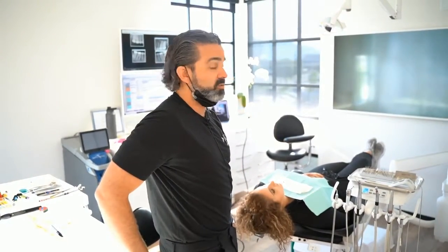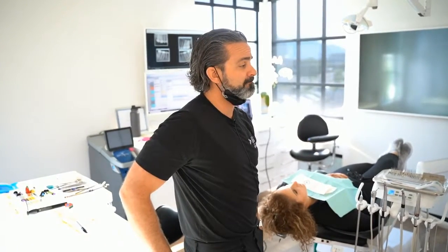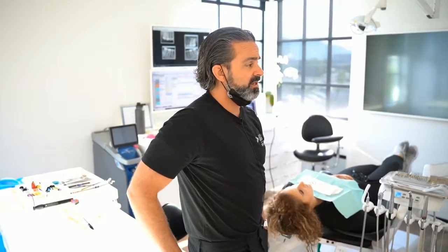None of our doctors use loops, but some doctors don't do examinations. The older ones, I do everything A to Z under a microscope. It's one of those workflow things.